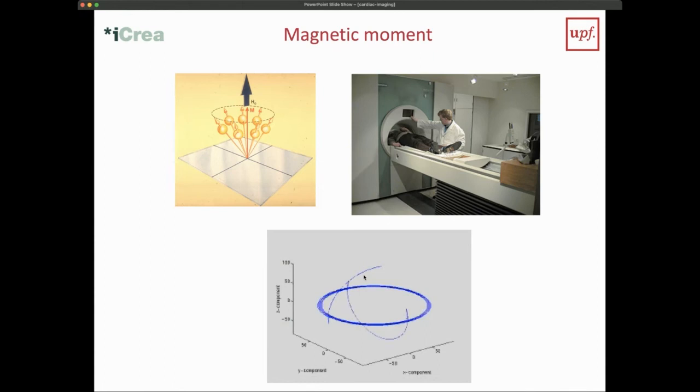So we are trying to look at how protons are distributed within the tissues and actually within molecules, because the molecular environment will determine how protons react to a local magnetic environment and to, as we said last time, the radio wave energy we can use to change the stable position.